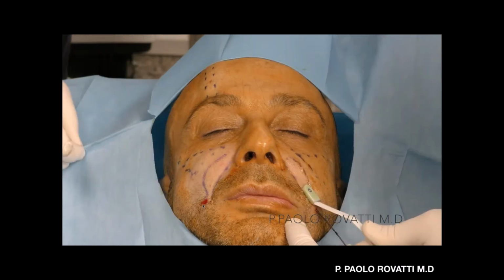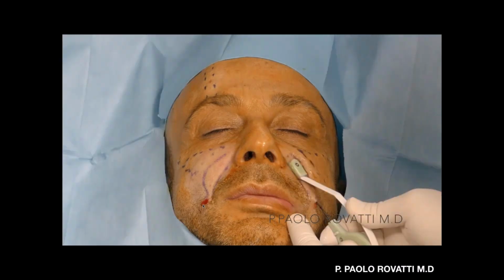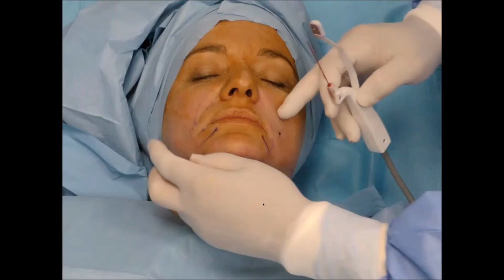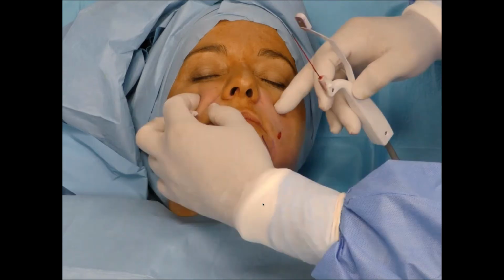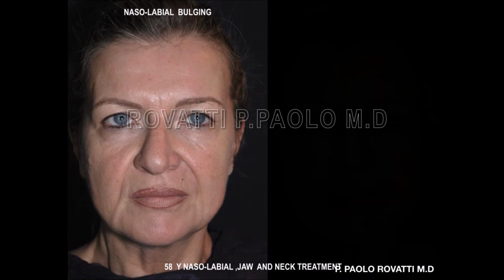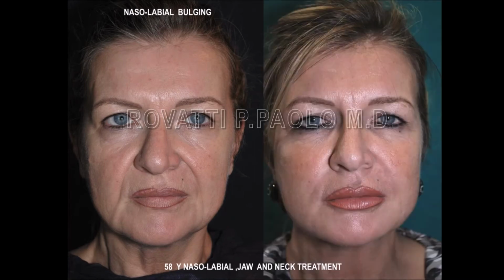Okay, now let's go. And maybe you have seen a lot of this one. Okay, this is what I've treated. Just on the left side is smooth and is better. And here you have more fat on this line. Just some cases, just to show you, this is a great nasolabial bulging, you can see, and this is really difficult to fill. If you fill here with a filler or with fat, maybe it's not good because you have more bulging of tissue. But when you treat and reduce a little amount of fat, in this woman you maybe have a good result, because in the mid phase, this is a great effort.